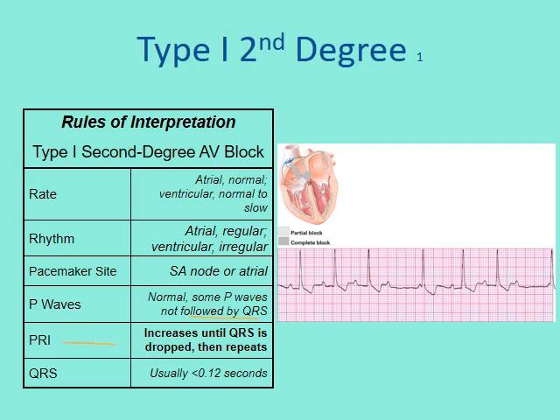We take a look here. Let's switch, let's do this color. It's about that long, gets a little longer, gets a little longer until it drops a beat. And then it starts over. Hey, there's a P, short, a little longer, until it drops a beat.